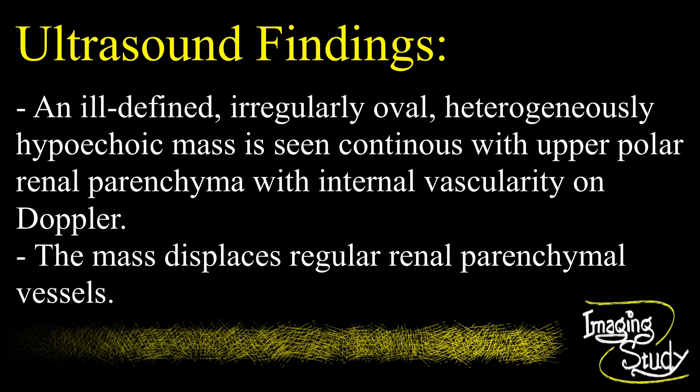an ill-defined, irregular, heterogeneously hypoecogenic mass is noted at the right renal upper polar region. The mass is continuous with the renal parenchyma, suggesting a renal parenchymal mass. On color Doppler, vascularity is noted within the mass, and the mass displaces the regular renal vessels.